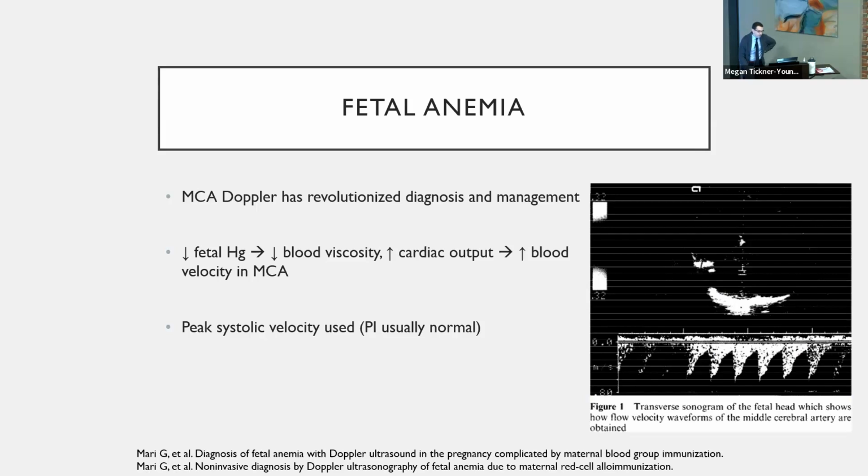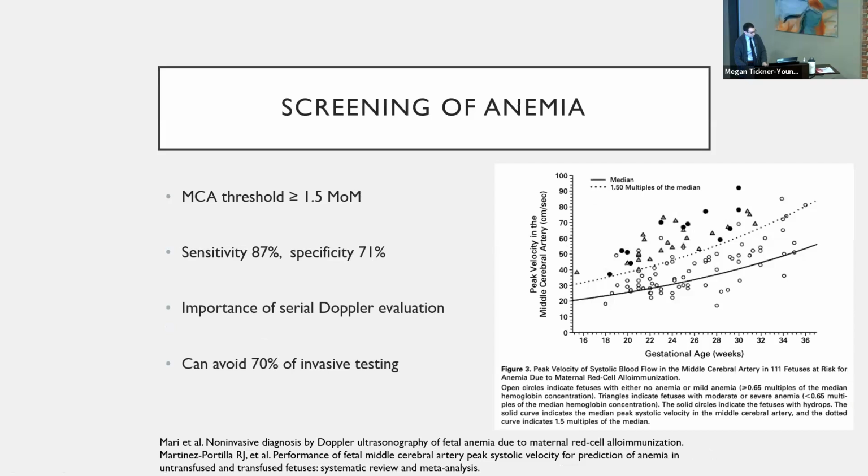Going back to the beginning of the presentation, it's an absolute value, and the angle of insonation is incredibly important for a proper diagnosis. This was an ultrasound image that was submitted with Mari's study on the MCA back in the mid-90s. So it shows how far we've come with Doppler, or ultrasound in general.